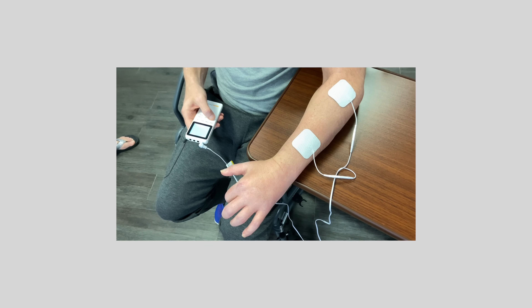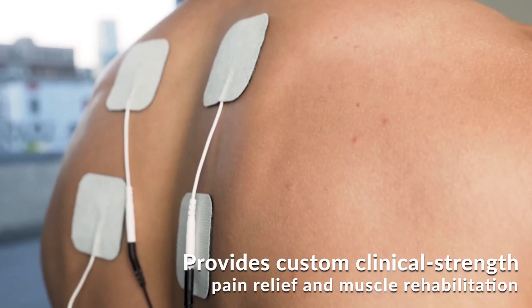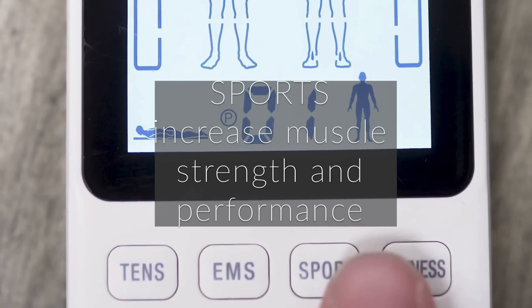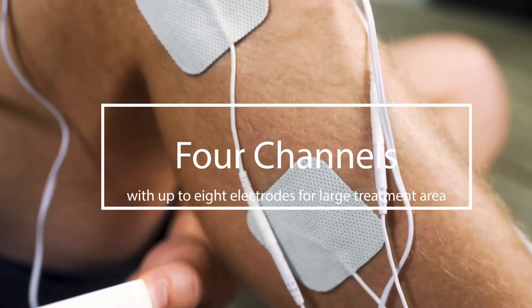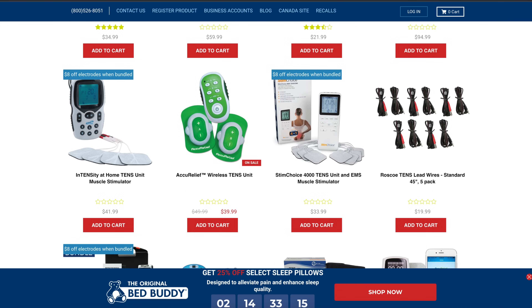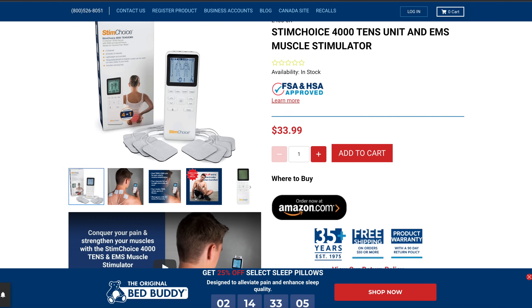I hope that helps you understand what electrical stimulation is and the most effective way to incorporate it into your therapy. The electrical stimulation machine that Carex sent me — I'm really loving it. I've used it on several patients, probably four or five patients more than once. It's very easy to use. It has both TENS and EMS, four channels so you can hook it up to two muscles simultaneously. The feature I like most is it has an on/off cycle, which I use most frequently when doing a functional task or using it in conjunction with mirror therapy. The buttons are big and easy to identify, so it can easily be used by someone with hemiplegia. It is probably the most reasonably priced machine I know of that does all of these functions.